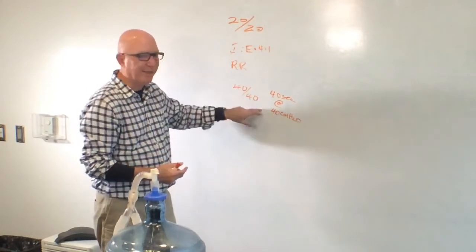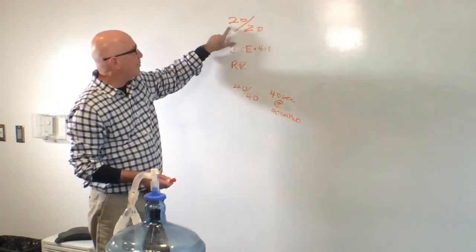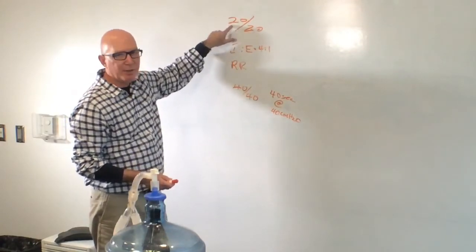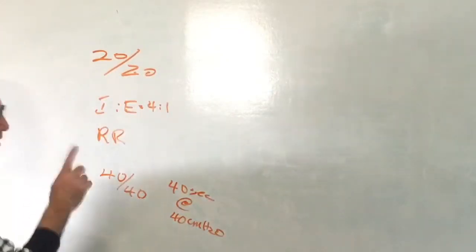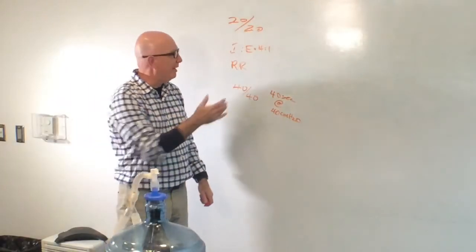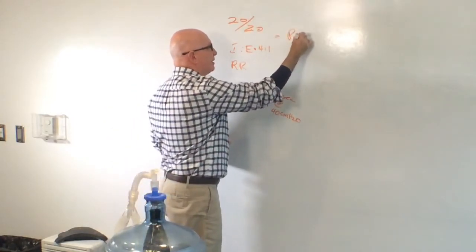So they'll tolerate this when you do these maneuvers. This particular maneuver cycles back and forth between 20 centimeters of PEEP and 40 centimeters of PIP, with a difference between the two of 20 centimeters of water with an I:E ratio of 4 to 1. Interestingly enough, if you choose to do that with the ventilator that you have, try this out with a test lung sometime. The important thing is the mean airway pressure that it actually creates.